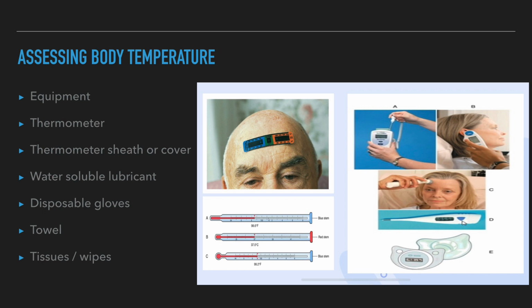2. Tympanic membrane thermometer. The tympanic membrane thermometer is a portable, handheld device resembling an otoscope that recharges using a battery pack. It records temperature through a sensor probe placed in the ear canal to detect infrared radiation from the eardrum. Some studies have revealed discrepancies between these readings and core body temperature, resulting in both false positive and false negative readings obtained using this device.